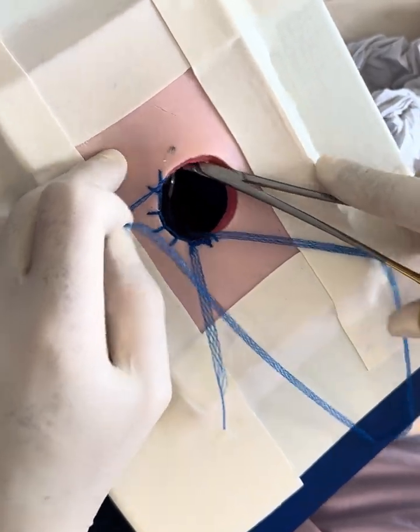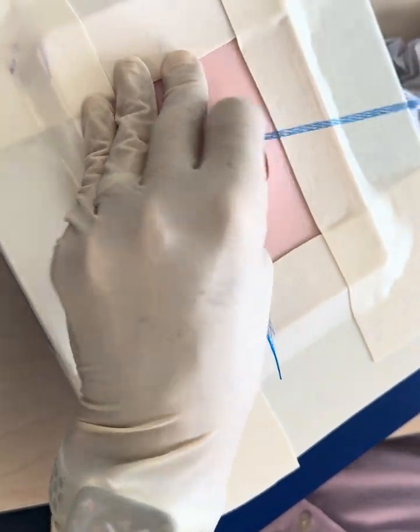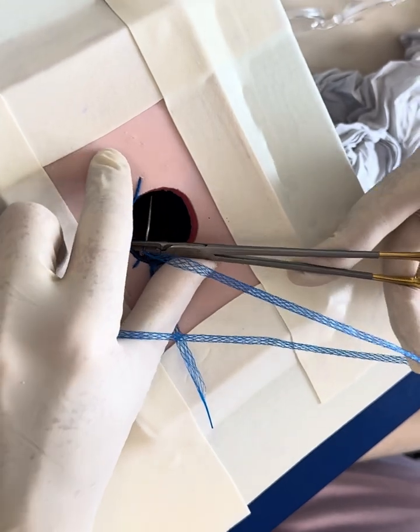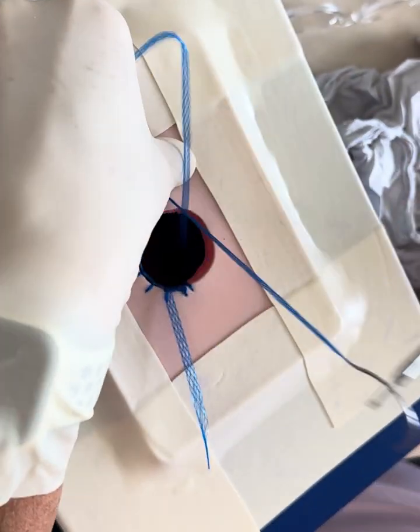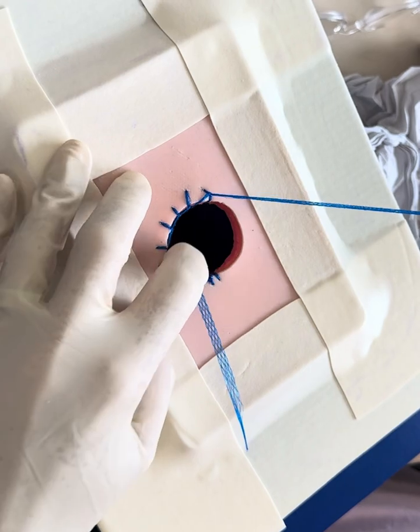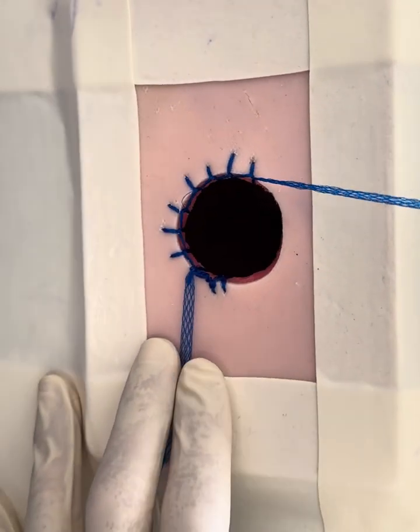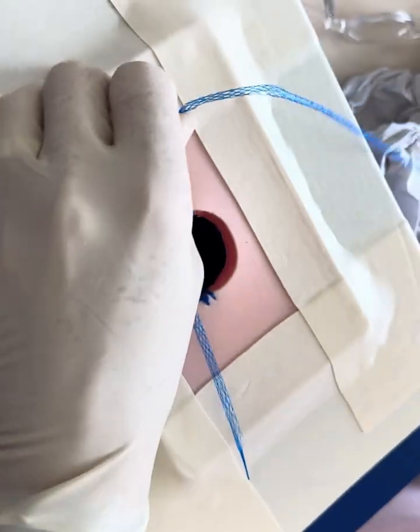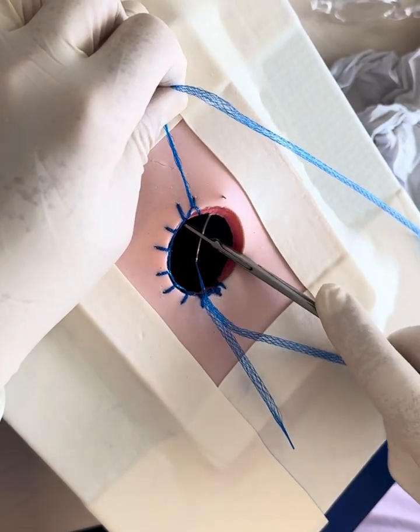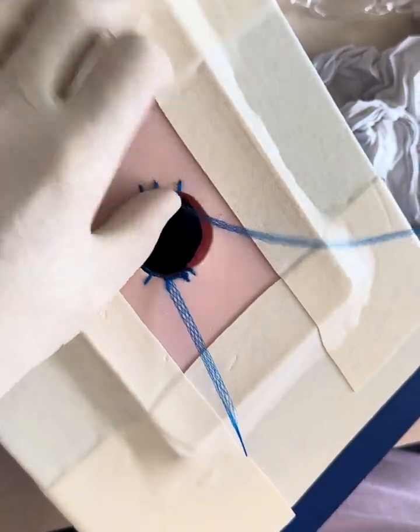And we then just progress on, continuing to lay that mattress suture. And because we're going inside to outside, it naturally brings the Duramesh directly into line with the muscle edge. Plus you can see if I tilt up, you're getting the strands of Duramesh reinforcing the full thickness of the muscle layer. So we'll carry on around so I can demonstrate the next bit of the technique. We'll just come round to our start point.